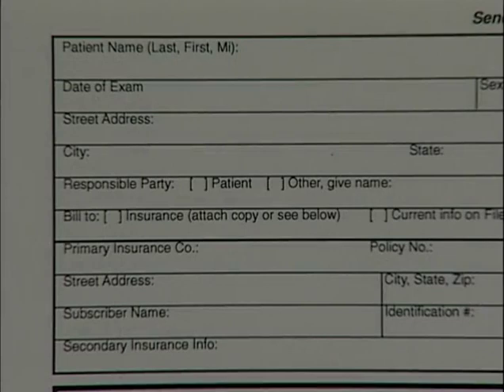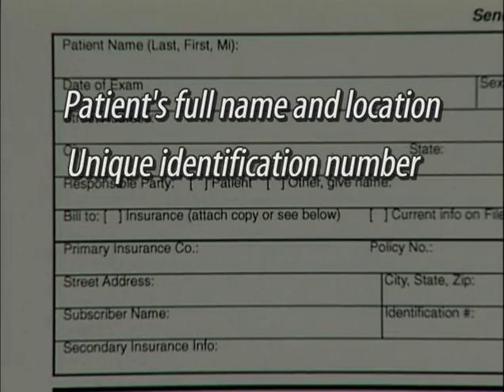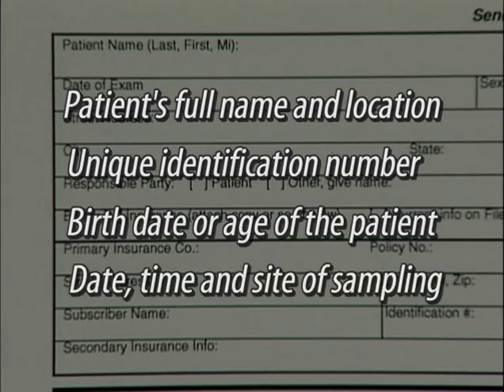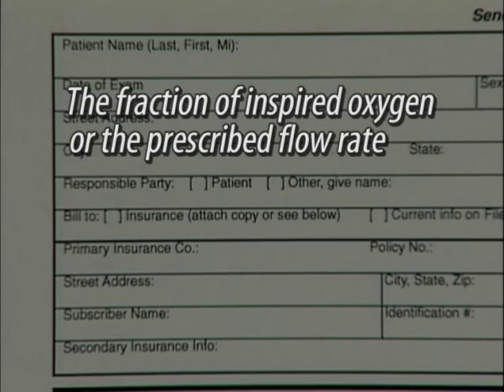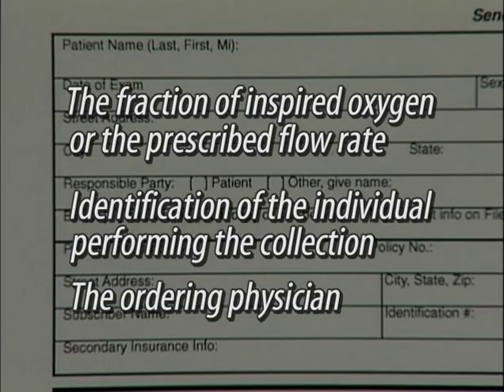At a minimum, the requisition should include the following information: the patient's full name and location, a unique identification number, the birth date or age of the patient, the date, time, and site of the sampling, the fraction of inspired oxygen or the prescribed flow rate, if applicable, identification of the individual performing the collection, and the ordering physician.